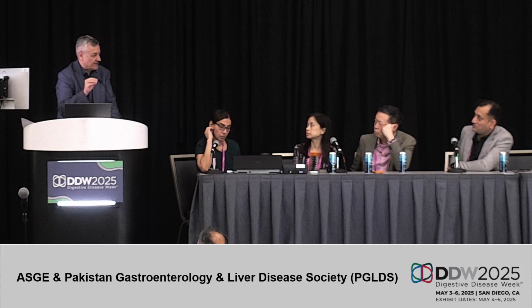If you have necrotic areas and you don't see any vessels, we prefer to target the areas where there are still a few vessels, so the viable portions of the tumor. But you need some sort of perfusion imaging, so you need contrast enhancement. I don't think elastography will help too much there, and Doppler or power Doppler don't help too much. You need contrast enhancement because you need to see the small vessels, which are visible with contrast enhancement.